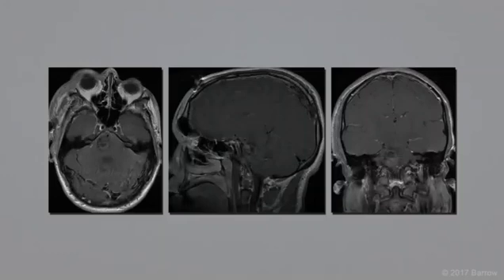Postoperative magnetic resonance imaging demonstrates complete removal of the lesion. The patient experienced no change in neurological exam postoperatively.